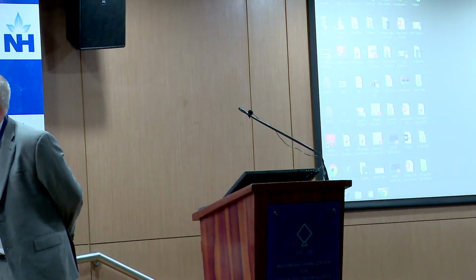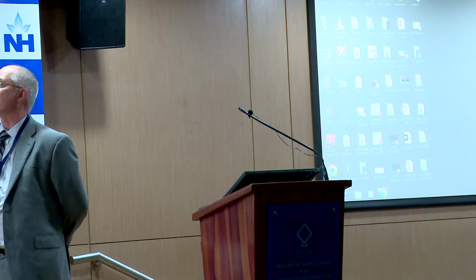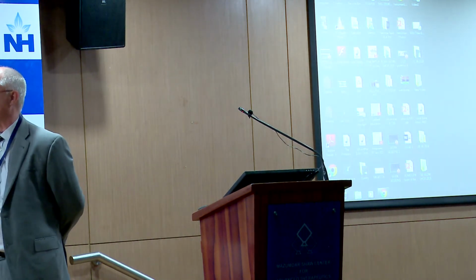So I have one last question. What is the status of the IVC collapsibility index right now? There are several papers which are questioning that. Because the technical IVC collapsibility index. So, how do you use it in practice? I've heard about the controversies.